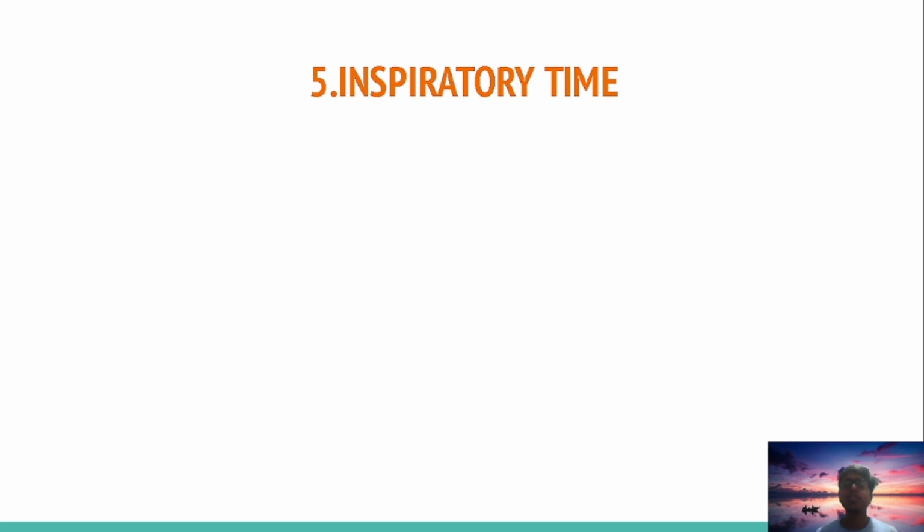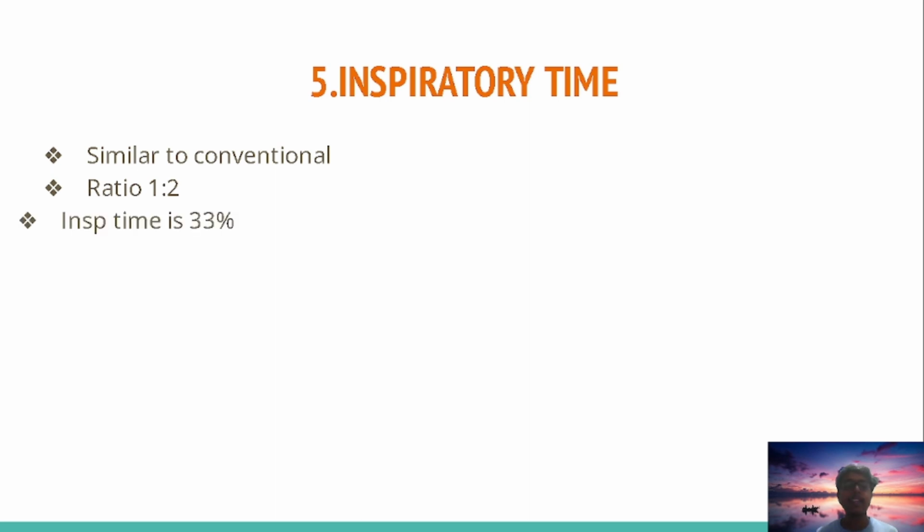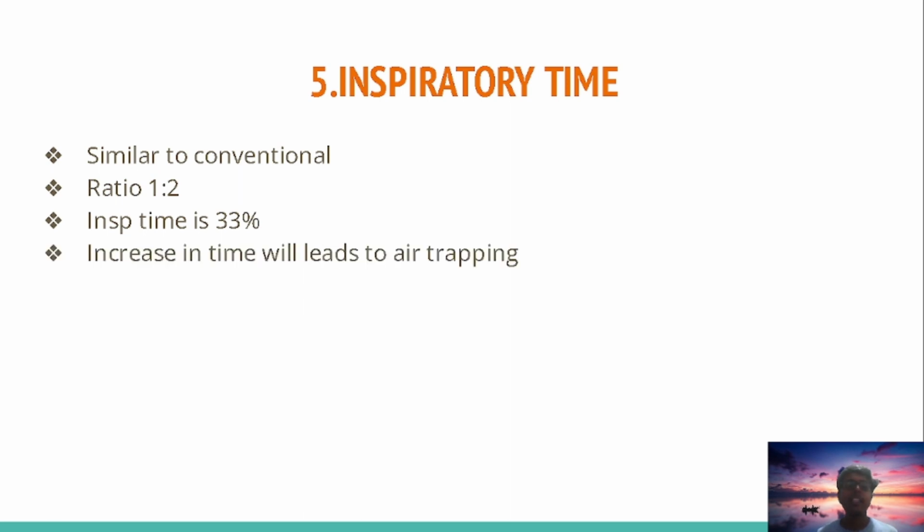Next, the fifth one is inspiratory time. It is similar to conventional ventilation. In conventional ventilation the IE ratio is 1:2, and we will set the same 1:2 ratio here. The inspiratory time is 33%. Increasing the inspiratory time will lead to air trapping.